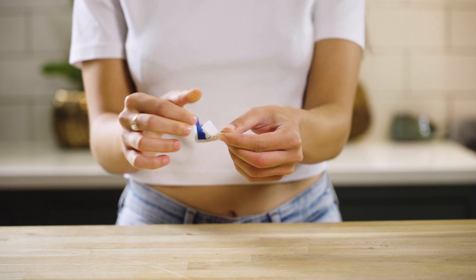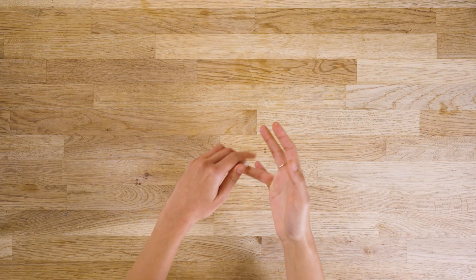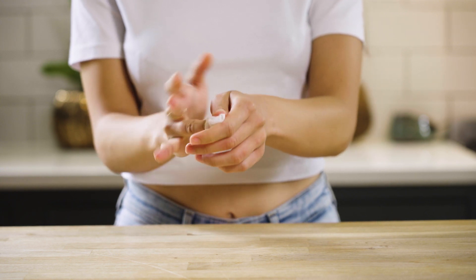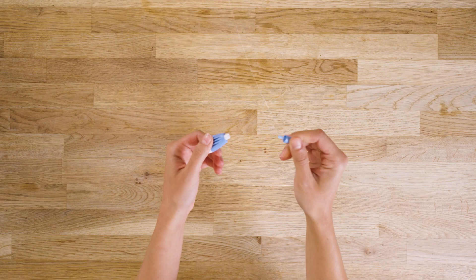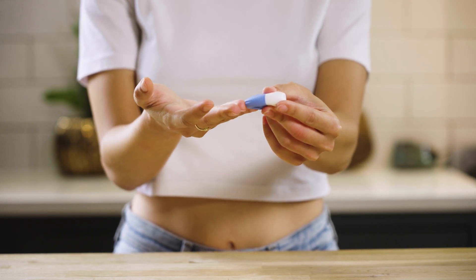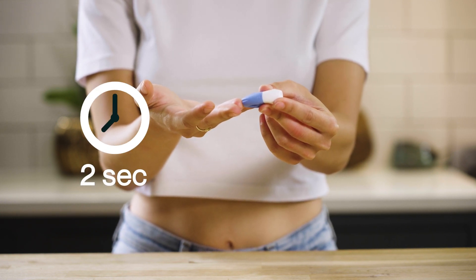Clean your chosen finger with the alcohol wipes. We recommend your middle or ring finger on your non-dominant hand. Remove the lancet cap and lay your hand down flat, facing up. Press the lancet firmly against your finger for 2 seconds until you hear a click.